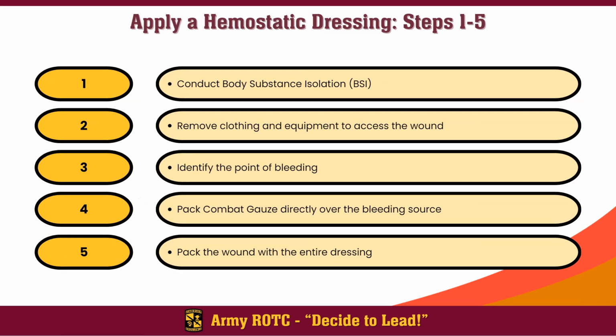So let's talk through our first process here. We're going to talk about applying a hemostatic dressing. Now, there's a lot of steps to this, so we're just going to go through them, and then we're going to watch a video that explains it in a little bit quicker time.